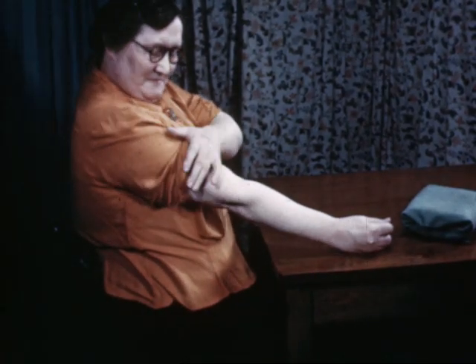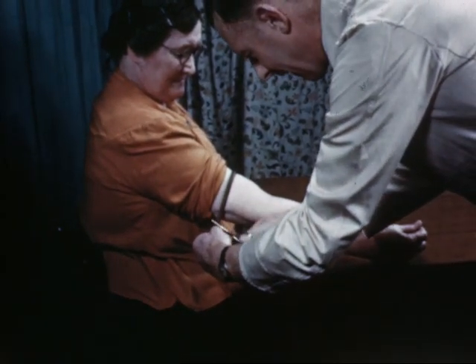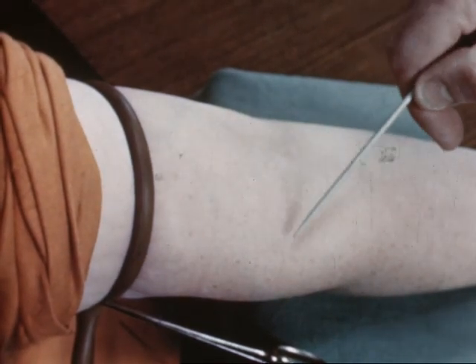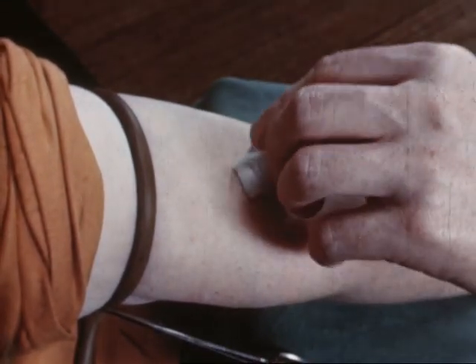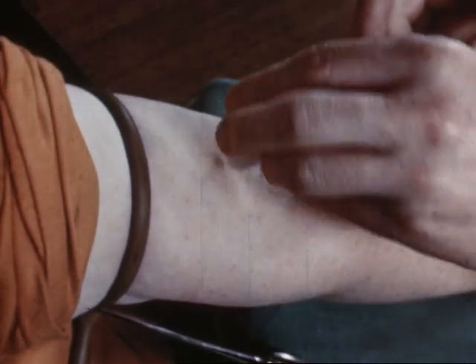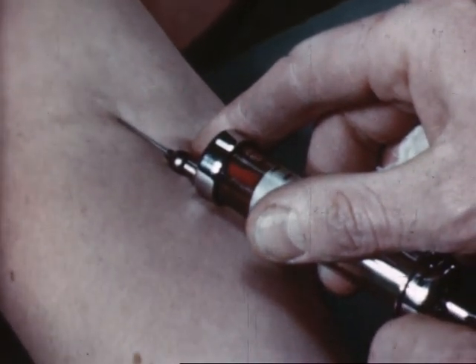In contrast to the last patient, here is a lady whose arms are not going to be easy for venipuncture. Suitable veins are often quite invisible, and these faintly visible ones can be very misleading, being in fact much smaller than they look. Find a good vein by palpation — do this lightly with the tips of your fingers. When dealing with difficult veins and fat arms, you can only become proficient and confident at venipuncture by constant practice.